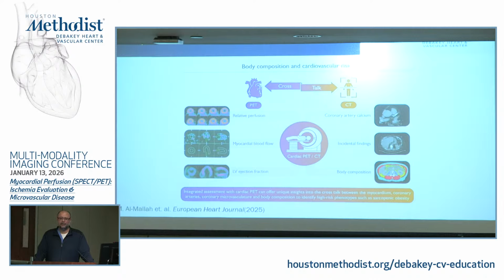Attenuation correction in PET is not an option, it's mandatory. Nowadays, the main method on the current new scanners is by CT. There are PET MRs that use MRI for attenuation correction, and there are some old source cameras that could use that.